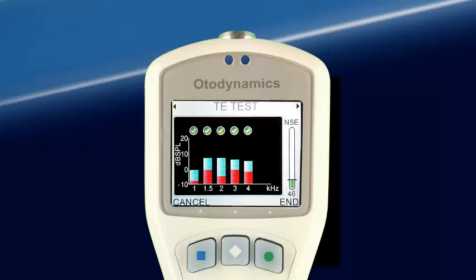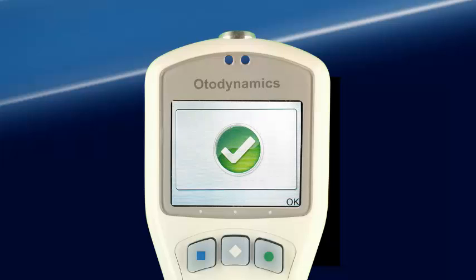When a signal-to-noise ratio of 6 dB is reached for any frequency band, a checkmark appears above that band. When a sufficient number of points have met the required criteria, the test is stopped automatically or manually by selecting End. When the test ends, a graphic results screen appears — in this case, a checkmark indicating that criteria have been met.